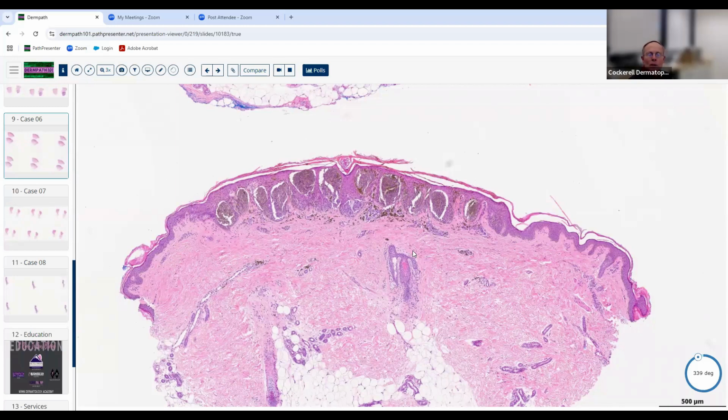The other thing I would just mention is that some parts of the body, like the ear, if you biopsy nevi on someone's ear, they very commonly have a spitzoid histology to them. I don't know why that is, but there are certain parts of the body where nevi develop certain special features based on the site where they're located. And on the ear, they commonly have a spitzoid morphology. So you want to make sure that you don't overdiagnose that as a melanoma in a young individual's ear, and then they have to get it whacked off when it's totally benign. So it's not good to overdiagnose either.